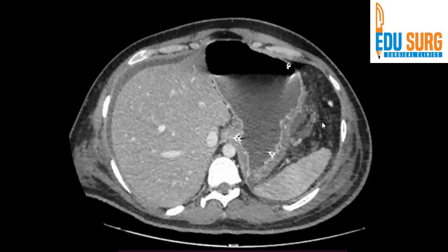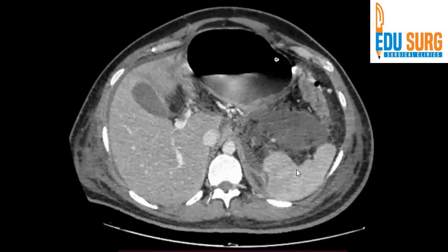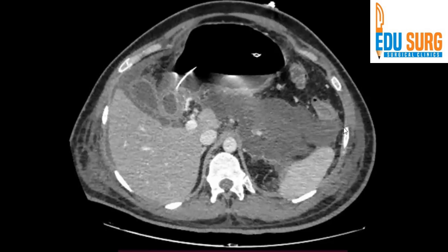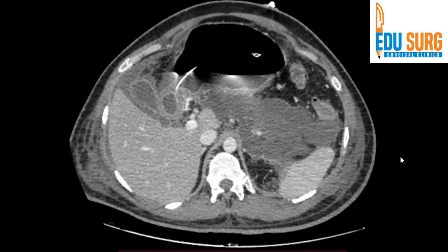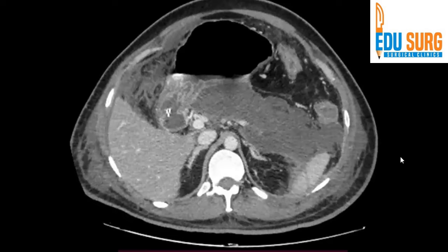You can see a lot of fat stranding in the abdomen. There is a big collection — you can see the extent of this collection. This is the spleen, this is the liver. If you can't identify the organs, we have different videos on it — go through those videos as well.